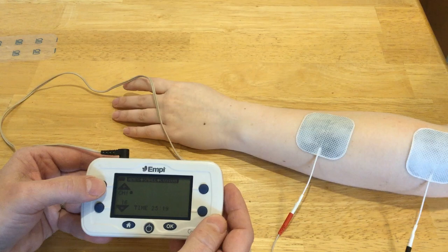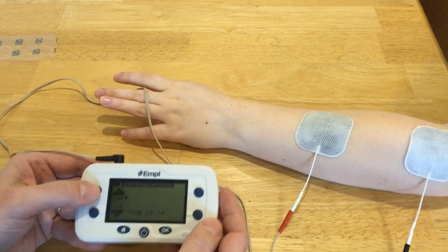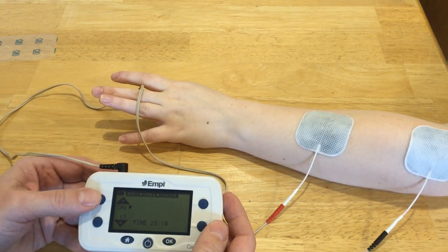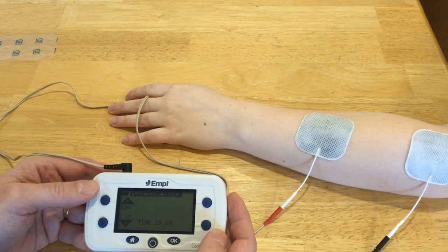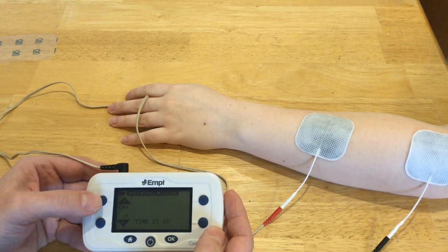So we got a pretty good response — extensor digitorum. You'll see it just ramped down and turned off, so we got a nice extensor digitorum contraction from our stimulation where the electrode is right now.